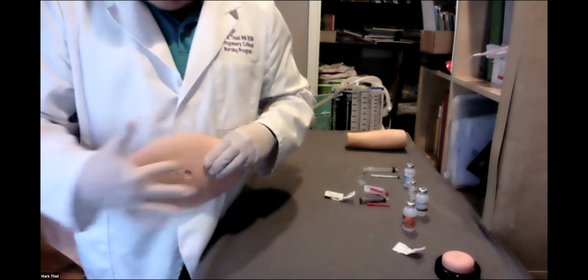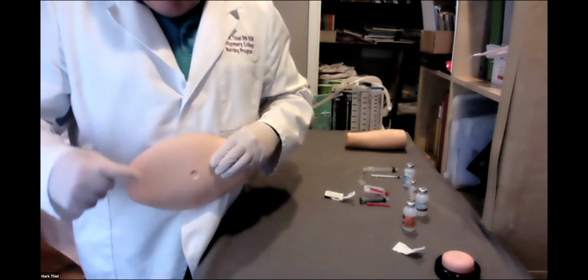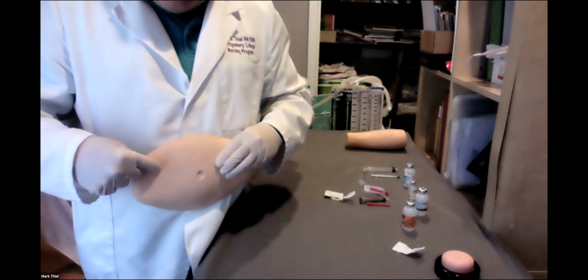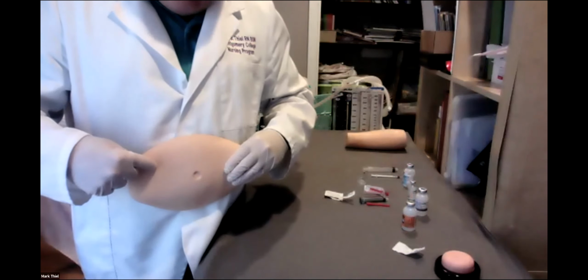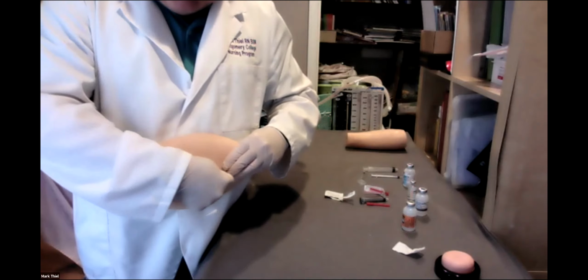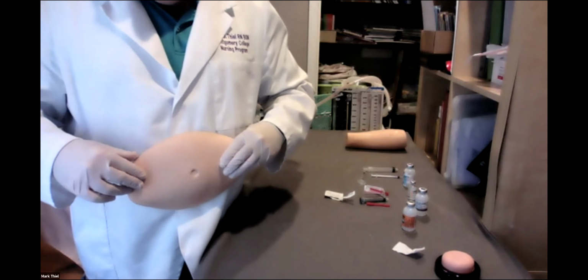Mentally, obviously, in your mind, I divide it into four quadrants. Breakfast of insulin, perhaps, for example, here, it's designated in the notes, right upper quadrant. Lunch, I have to inject coverage for regular insulin, here, and so forth. You would rotate your sites.